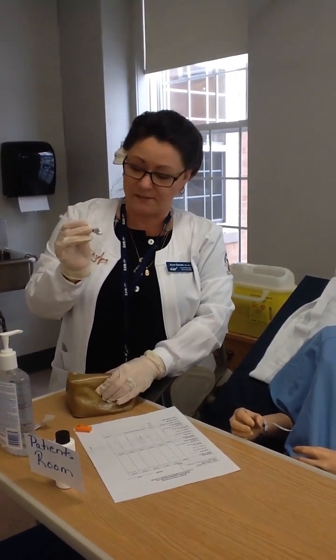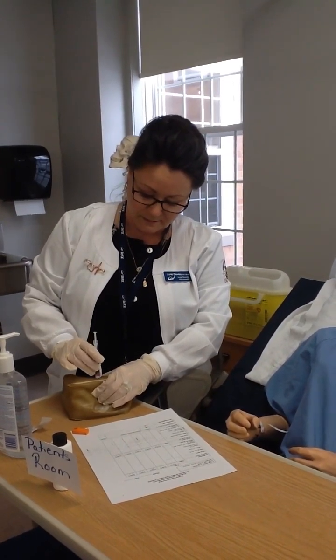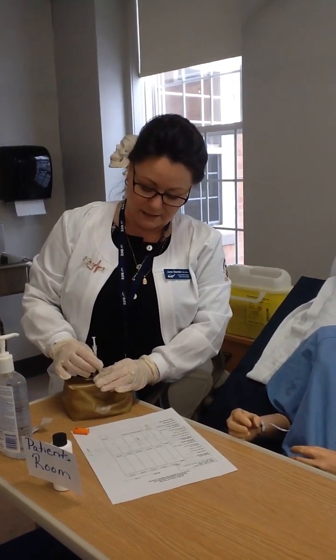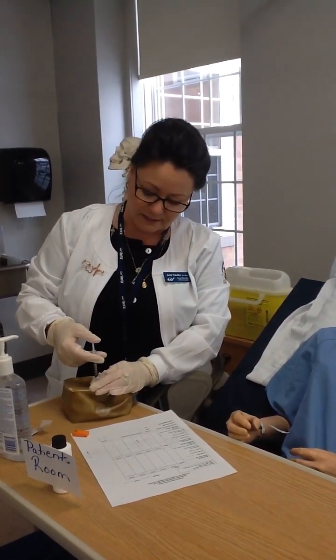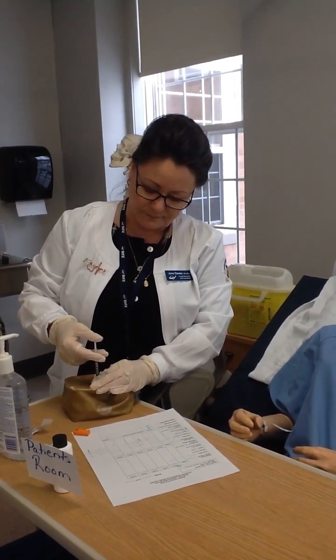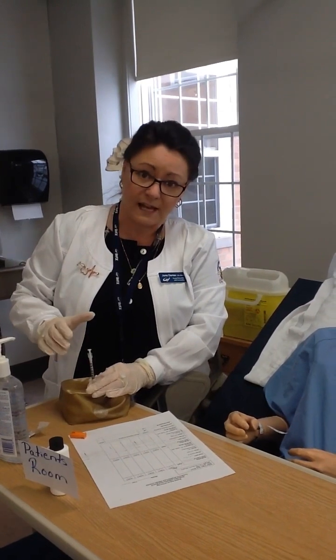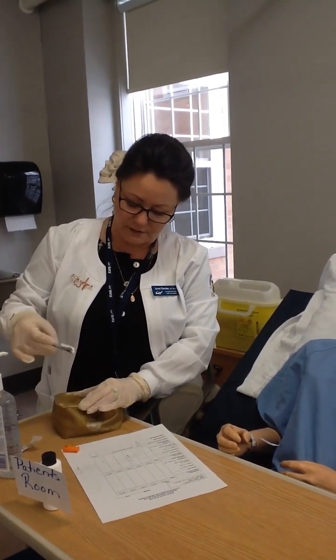That needle is very, very fragile, so I'm going to be careful. I'm going to inject right to the hub. Let go of the pinch, unless it's heparin. Stabilize the needle. We always stabilize the needle. Inject our medication. Wait a few seconds. Pull the needle straight out and away.